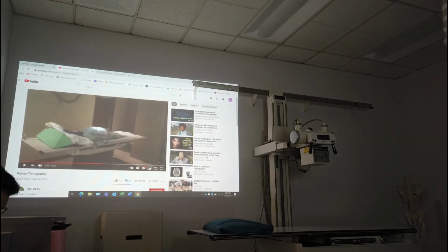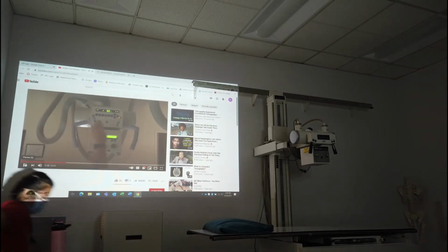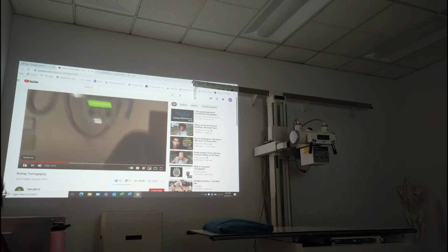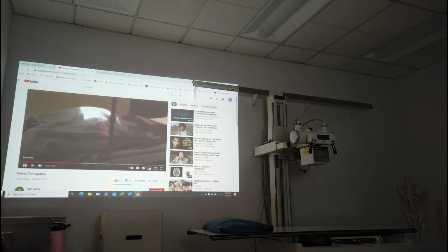And I actually have a video of it here. See this particular tube here, you can see like a 9 on there. So that's like the fulcrum right there. So she's setting the fulcrum. And she's got her cute little calipers. You guys see me use those in class, right? So they're measuring the patient. I don't know what she's saying, but she's probably talking about how to take the measurements and figure out where the kidneys are and all that stuff.